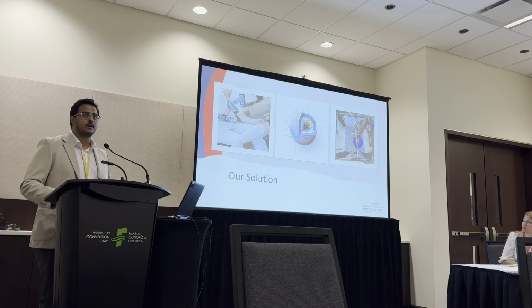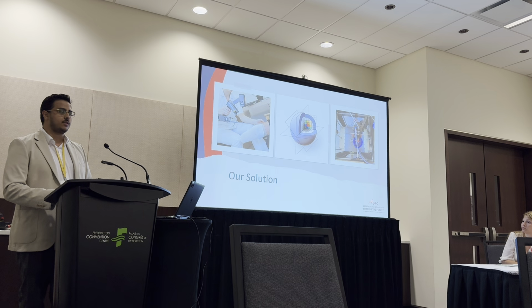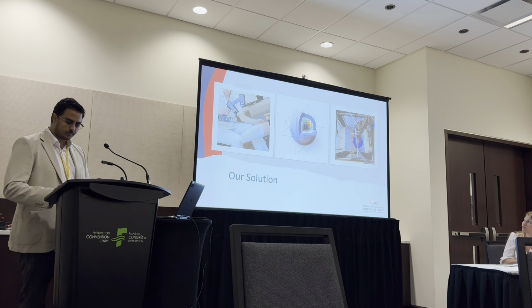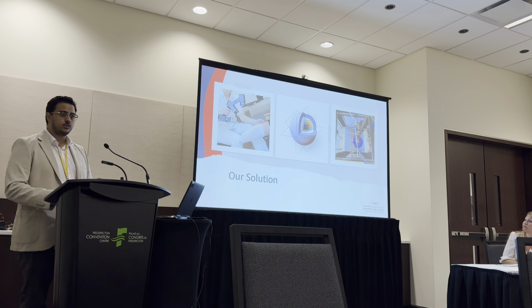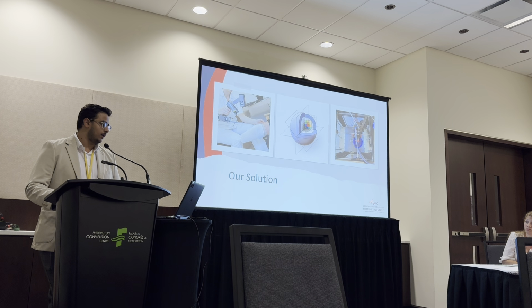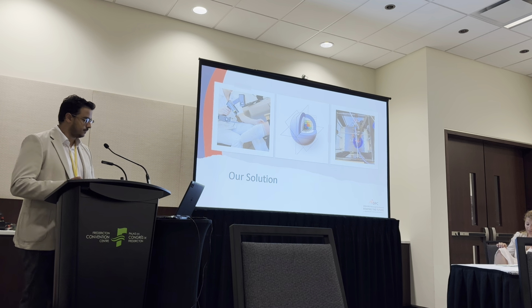We would then 3D print the insert and have it integrated into their existing sockets, removing the need to get a new socket completely during that initial stage where they're going through many sockets until they can finally stabilize. It's important here to note that this is an insert. It's not a liner. Inserts are likely to be used in conjunction with liners. The insert is simply reconstructing the inside shell or the inside surface of a socket.